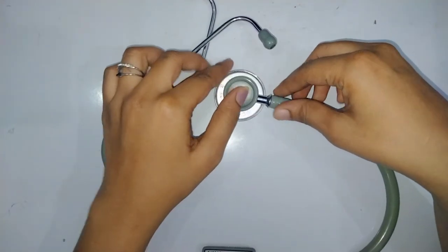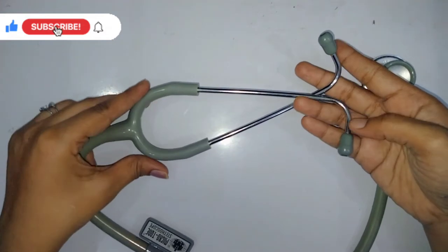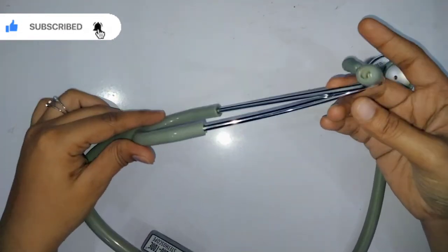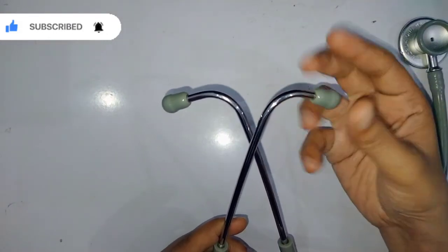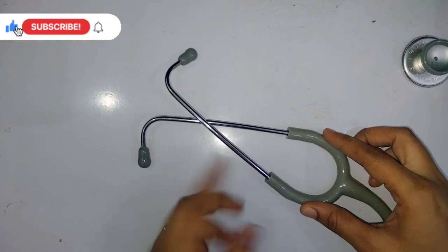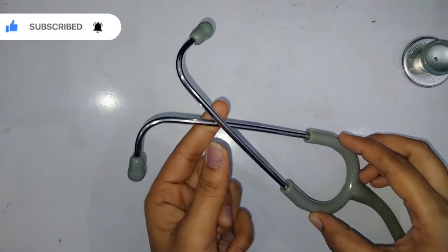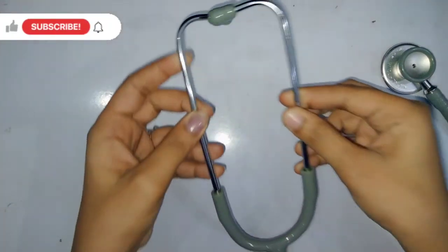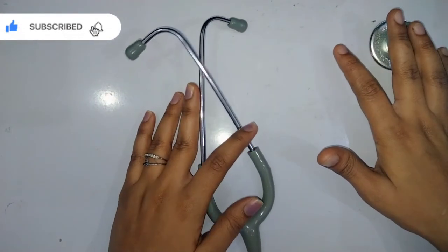Now the important part — how to wear the stethoscope. Many people don't know how to wear it correctly, so here's the trick: the ear tips should always face forward. Place the stethoscope over a table, ensuring there's no space between the ear tips and the surface, then open it and place it over your ears. This is the correct way to wear the stethoscope.